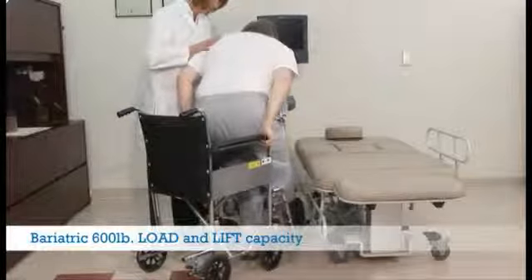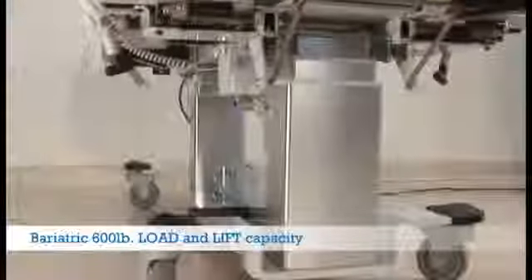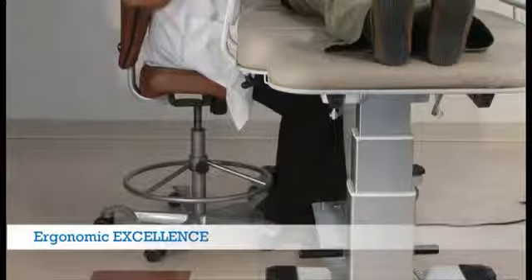Oakworks' bariatric 600 pound load and lift capacity comes standard on all of our tables. Our very stable two-column design and heavy-duty construction ensure that even your largest patients will feel safe.